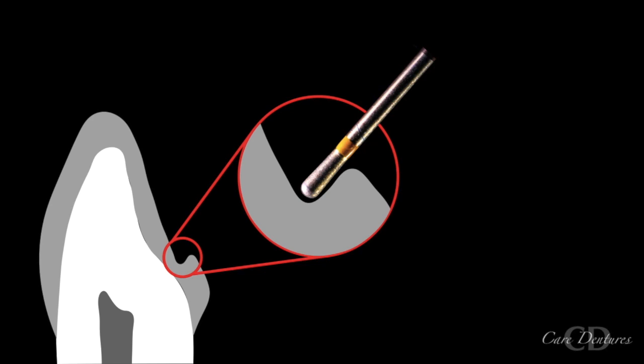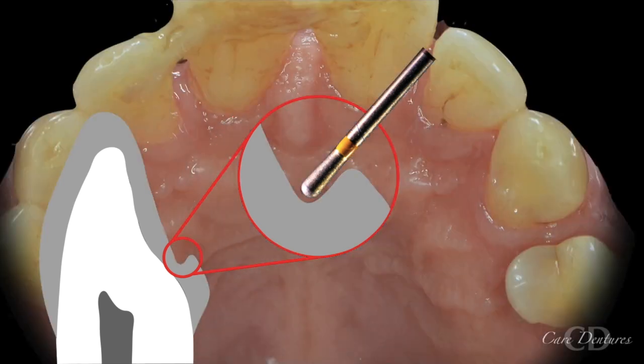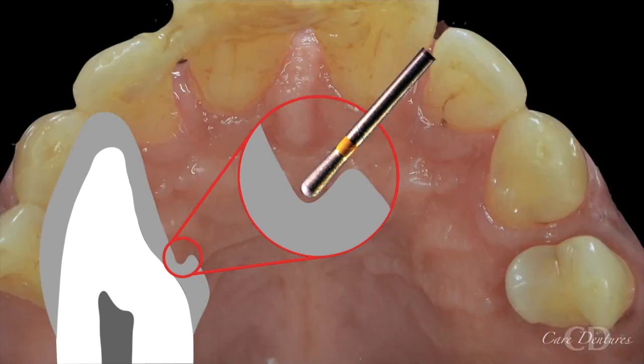Do check it out. An intraoral photograph shows the extent of the rest seat on a canine, spanning on the palatal surface like a crescent. Look at the extent, with the edges narrowing out gradually as we move away from the center.